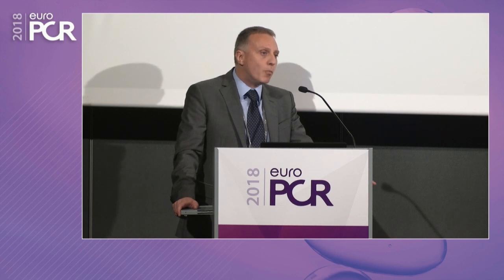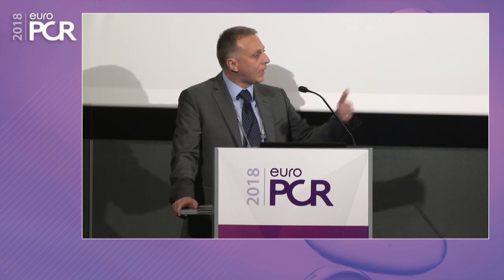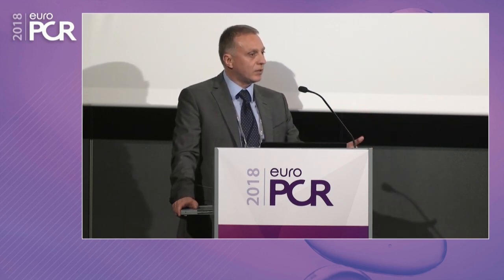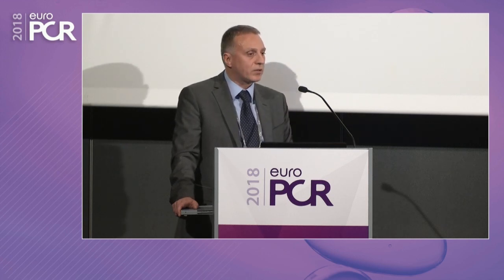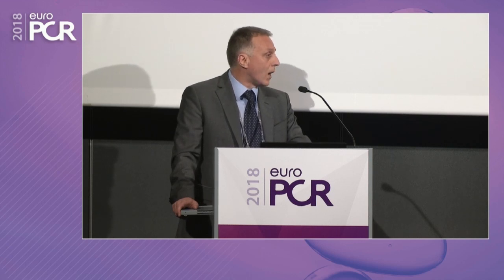With the complexity induced in terms of steps by the DK crush, so performing a first kissing and then another kissing at the end, the possibility to have a very good opening for the side branch that allows good expansion of the stent struts increases. But again, there is an issue with the rewiring.